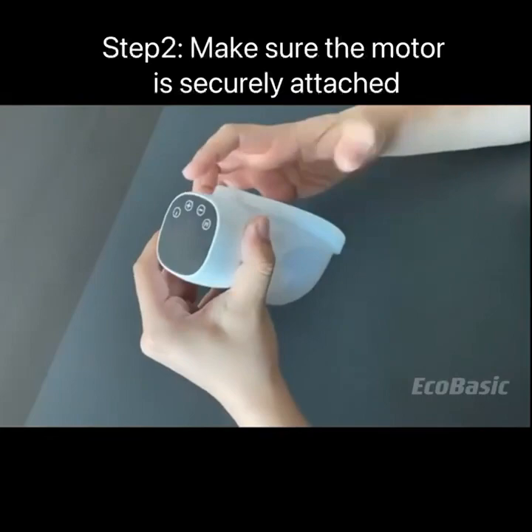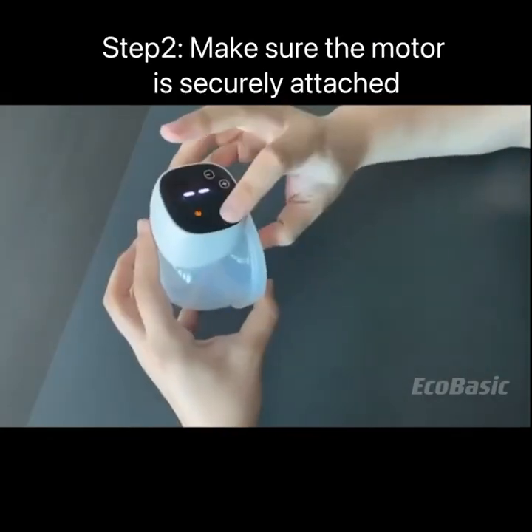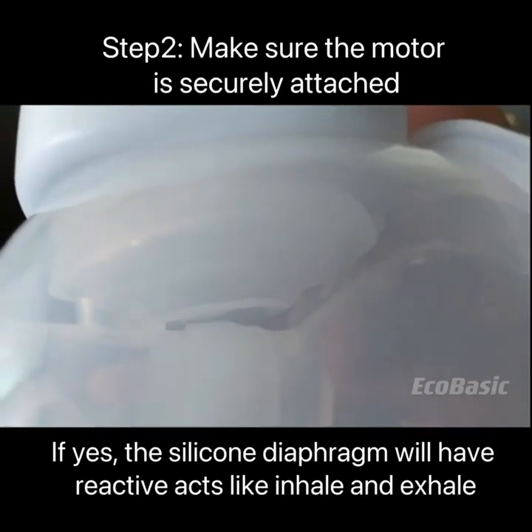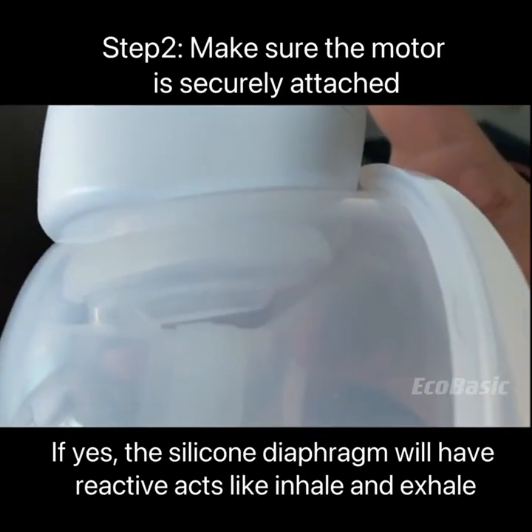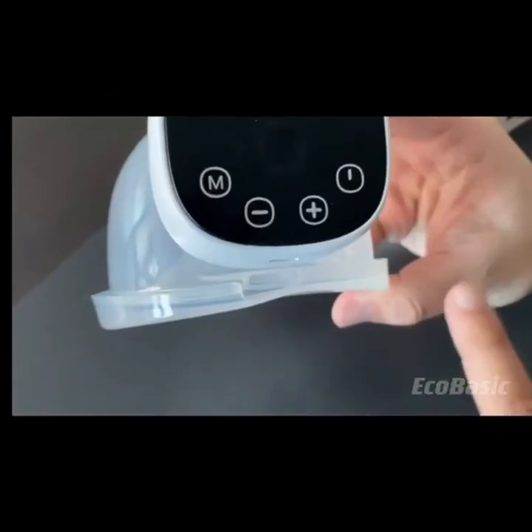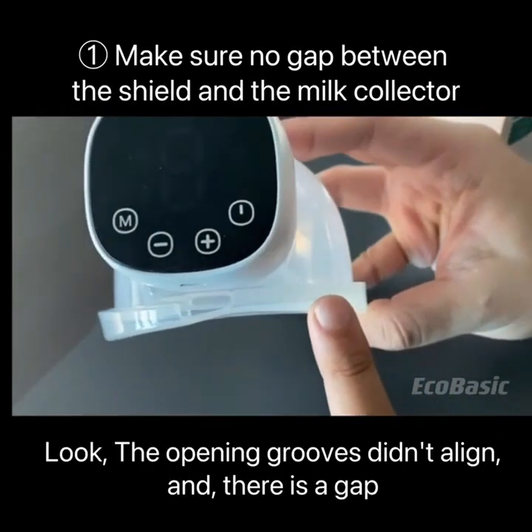Step 2: Make sure the motor is securely attached. If yes, the silicone diaphragm will have reactive movement like inhale and exhale. If not, try to assemble again. Make sure there is no gap between the shield and the milk collector.